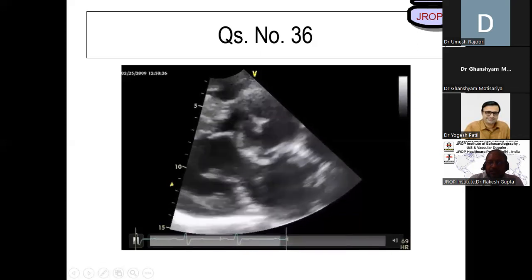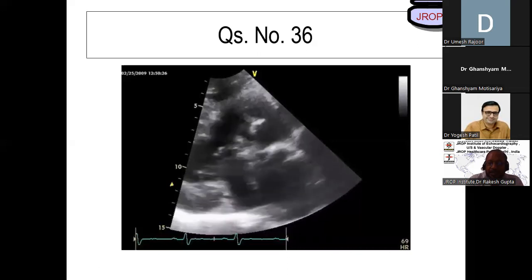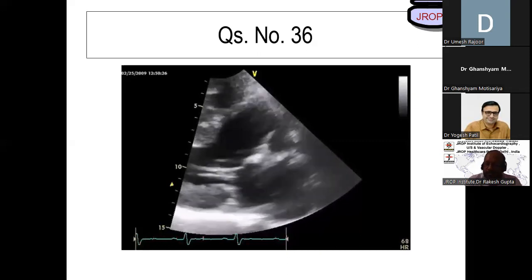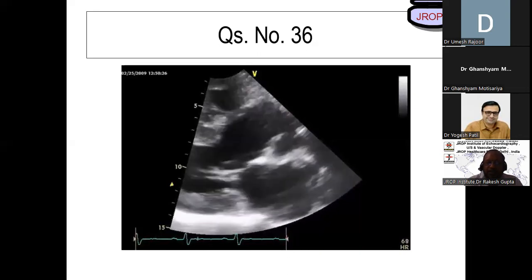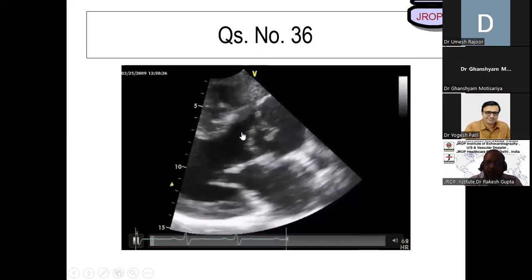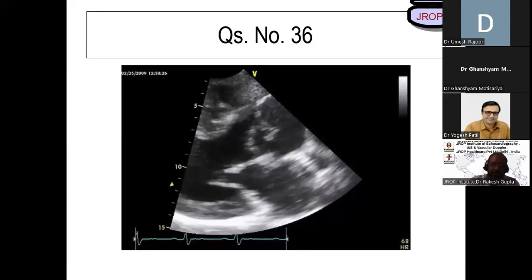If I switch on the colors, you'll find aortic regurgitation. I don't say severe, I'll say aortic regurgitation. Then you have to look at all three cusps of this patient. RV looks to be high, LV looks to be hypertrophic. So this is a child born with prolapse of the non-coronary cusp of the aortic valve. So that's how we go. All right, Anupa, I'll give you 3 out of 4, but you have to really update yourself.